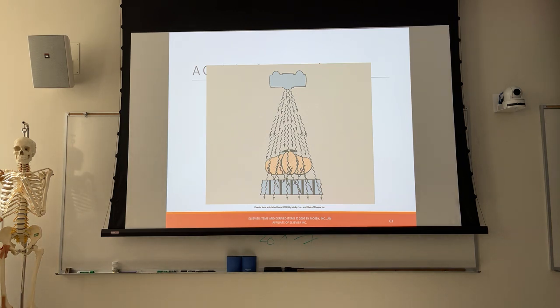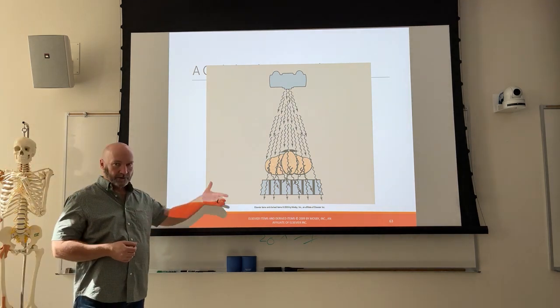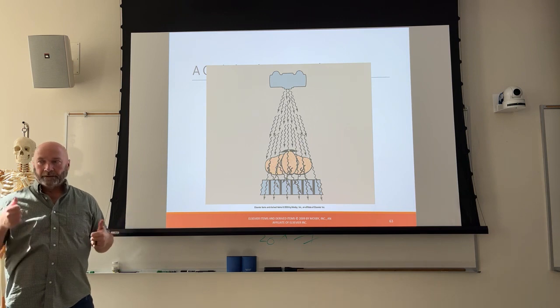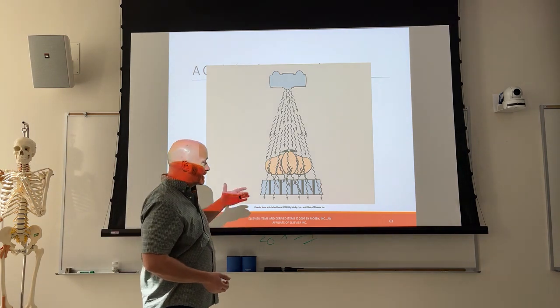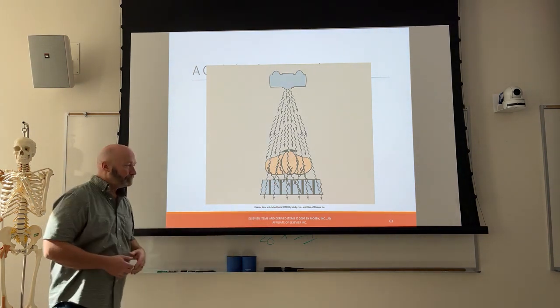All right, then we're going to start with grids today. Everything that we've done so far has had to do with scatter creation. Now we're going to concern ourselves with scatter cleanup after it's created. To prevent it from being created, proper kVp, beam restriction, compression possibly. Still going to create scatter radiation, especially if you have soft tissue. So now we've got to clean up what does get scattered.